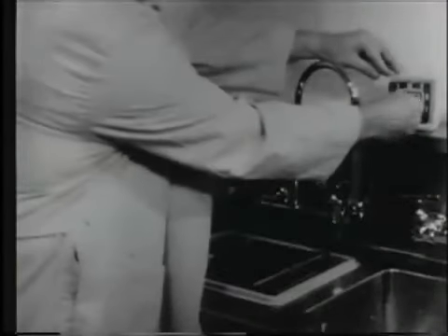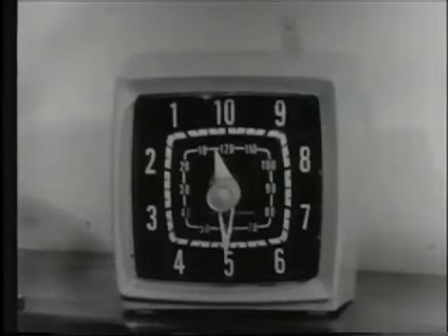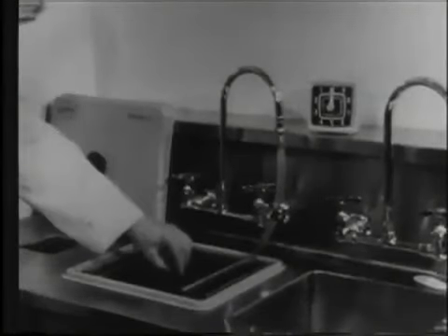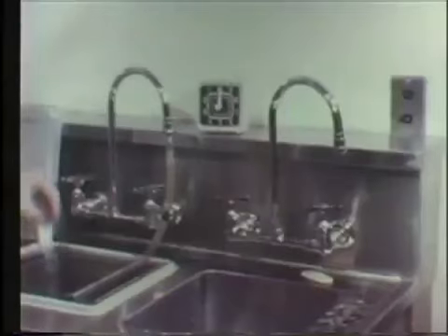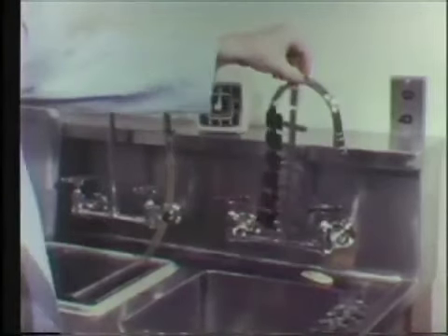Then we must set the time clock for 5 minutes in the fixer. Then we activate it. 5 minutes now has passed. Then we rinse the films and allow them to remain in the water. Now we'll set the timer for 20 minutes and turn on the white light. Now we could open the door of the processing room. All right, at the end of the 20 minutes, the timer indicates, and so then the films are set aside to dry.